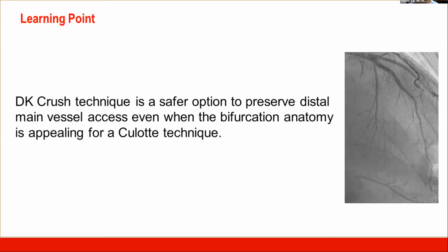Certainly using OCT and co-registration, as Richard alluded to earlier, because sometimes you can't tell exactly where the carina is because of the angles on fluoro. But with OCT, you'll know exactly, whatever angle you want to be in, where the proximal edge of the stent must land.